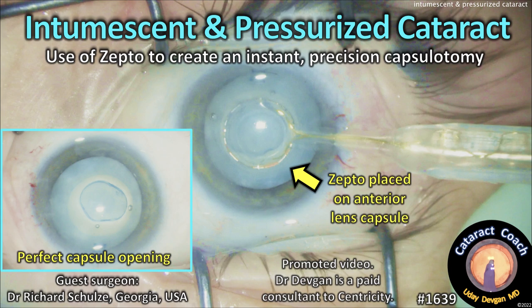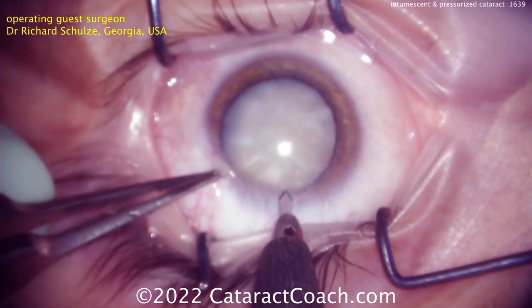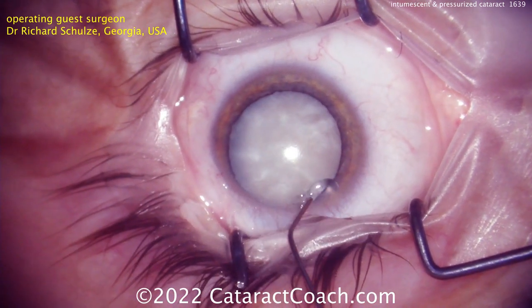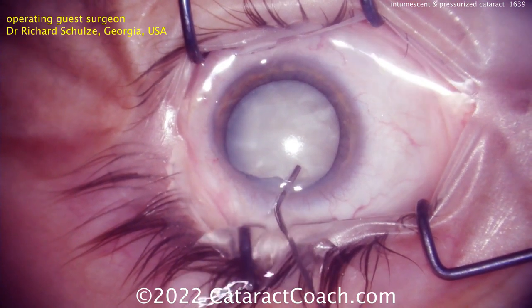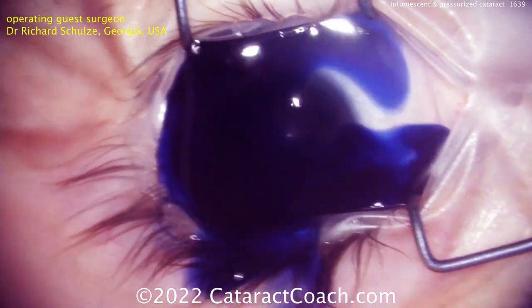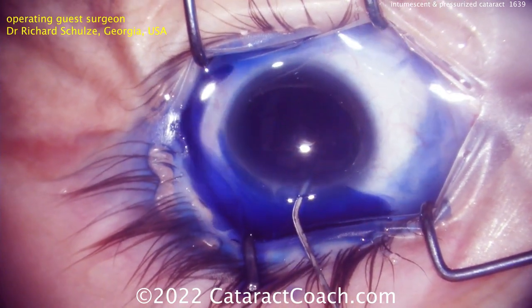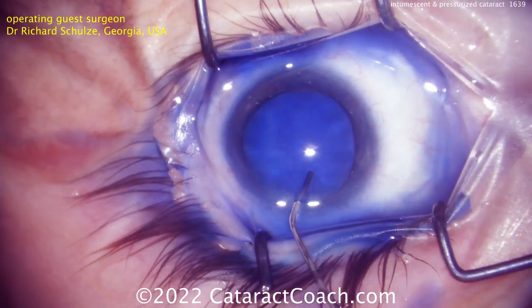From cataractcoach.com: intumescent and pressurized cataract — use of Zepto to create an instant precision capsulotomy. This is a tough case submitted by Dr. Richard Schultz from Georgia. You can see it's a totally white cataract, but it's more than that — it's intumescent or fluid-filled, which means the capsular bag is pressurized. The intralenticular pressure is high, so trypan blue dye is being applied. A capsulorhexis is needed, but it's not easy because the risk of an Argentinian flag sign or a runout of the capsulorrhexis is very high.